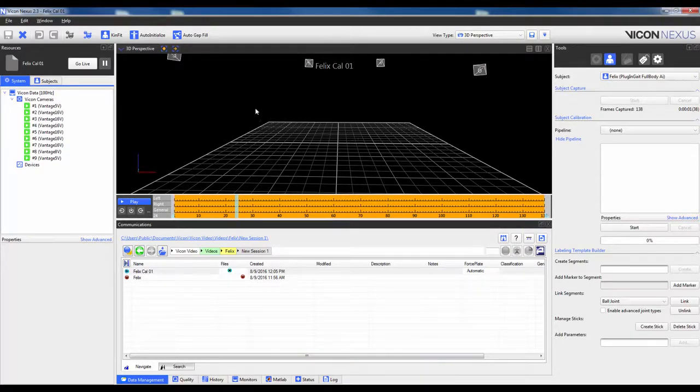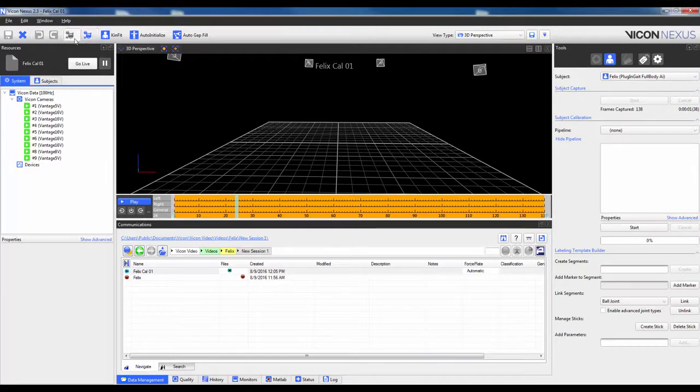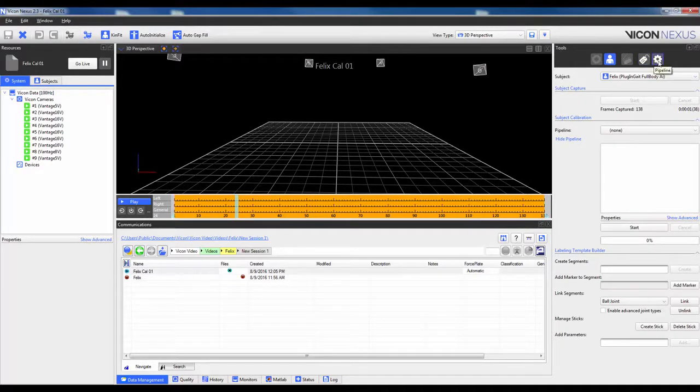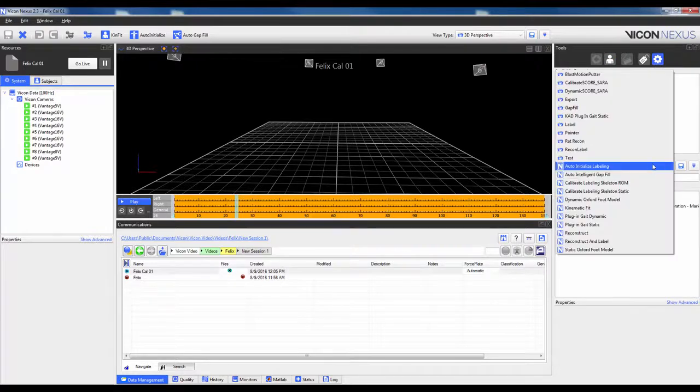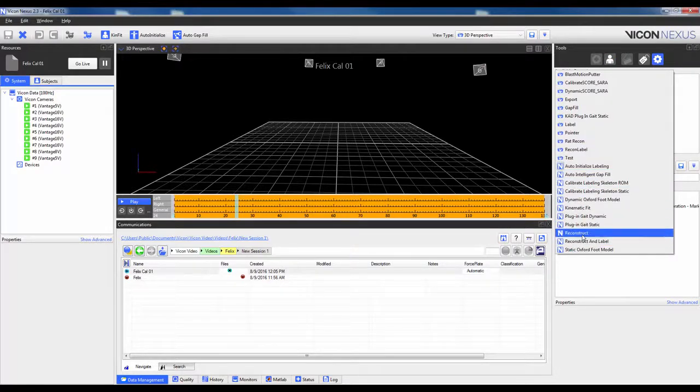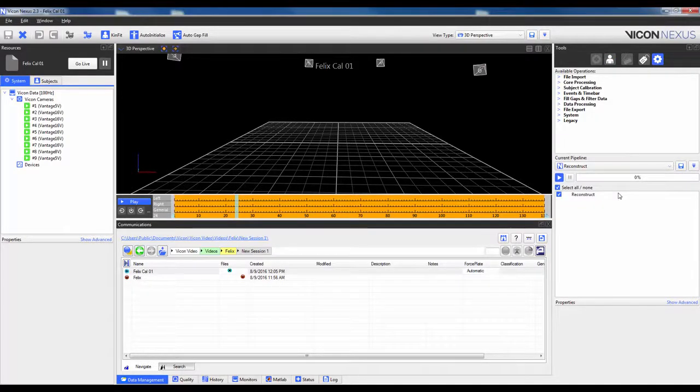This procedure can either be done from the toolbar, which is really just running the pipeline, or from the pipelines list, which is over here. So I can switch this to reconstruct. I will do this from the toolbar.